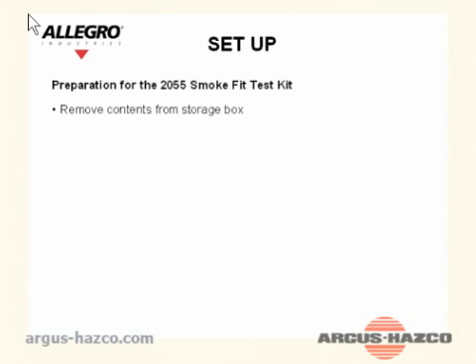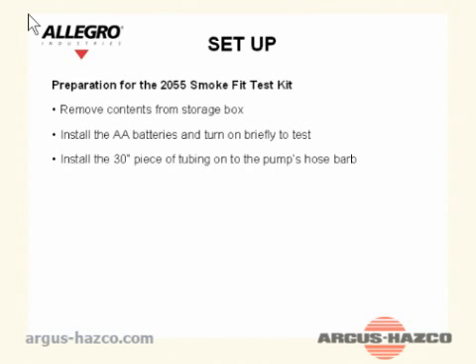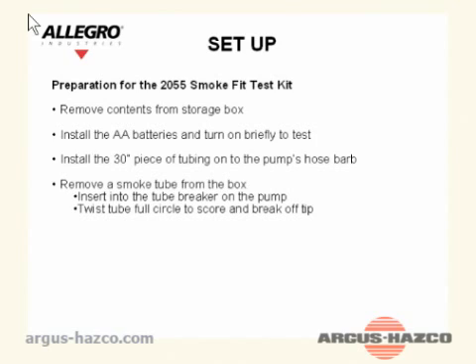Setup — Preparation for the 2055 smoke fit test kit: Remove the contents from the storage box. Install the AA batteries and turn it on briefly to test. Install the 30-inch piece of tubing onto the pump's hose barb. Remove a smoke tube from the box and insert it into the tube breaker on the pump.